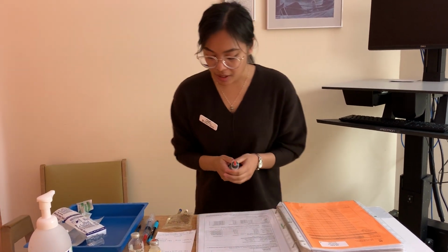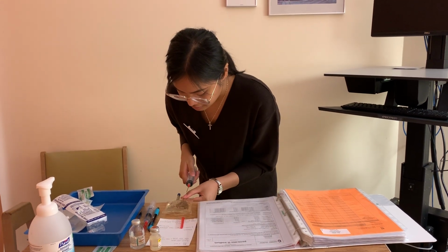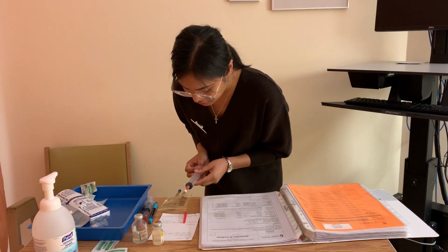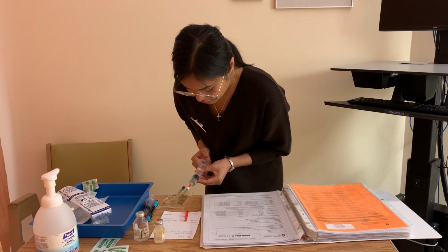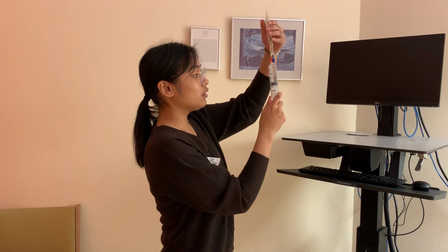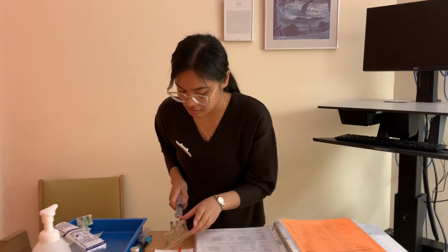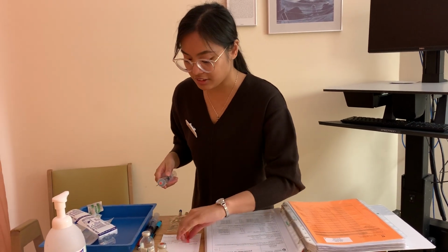Okay, and now I'm just going to collect my 20 mLs of fluid, making sure not to puncture the bag. So I'm going to get my 20 mLs. This can go into med waste, as well as these two. These can go into med waste.